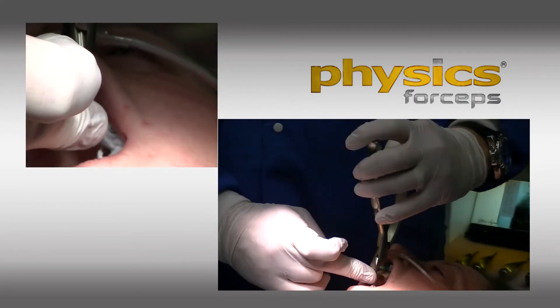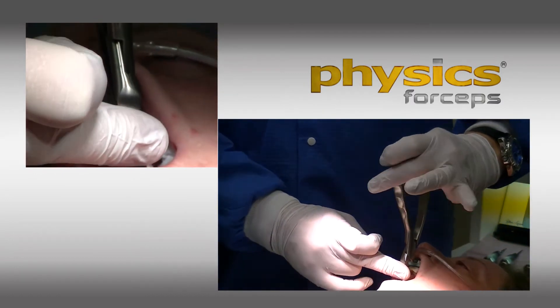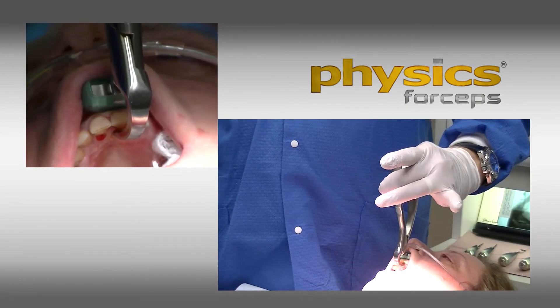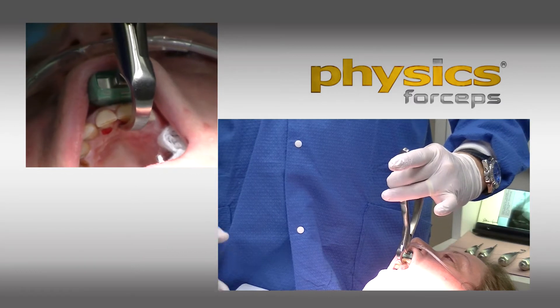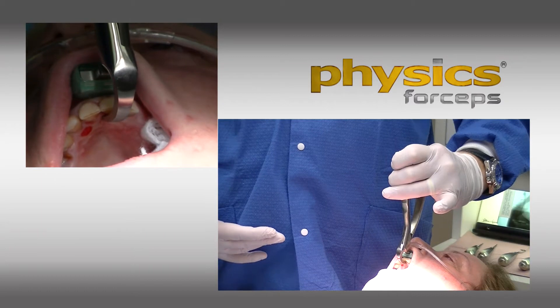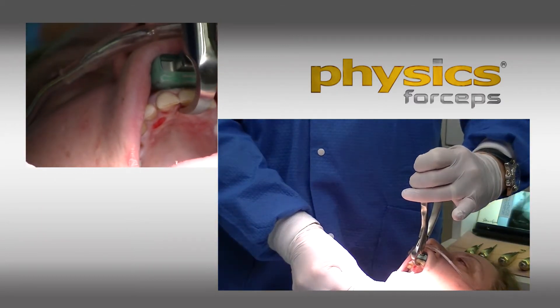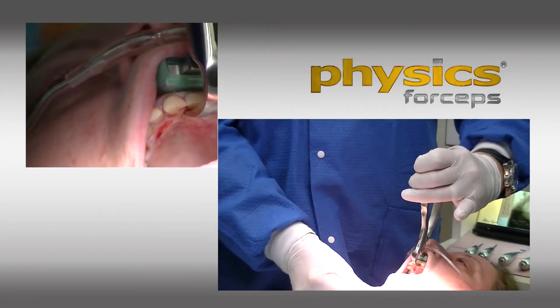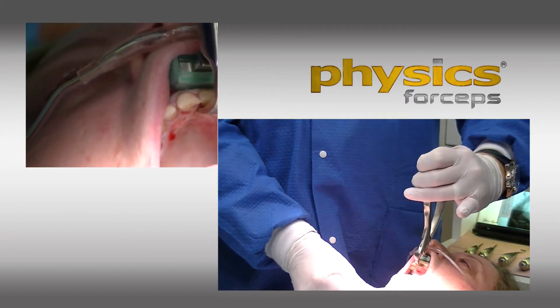What I have is the beak engaged onto the palatal surface and the bumper high up the vestibule as possible. I'm using really just two fingers — a finger and a thumb — and I'm rotating my wrist. There's no forearm pressure, no bicep pressure. I'm just slowly rotating my wrist towards me. Not moving my arm, not squeezing like typical forceps, but simply rotating my wrist.